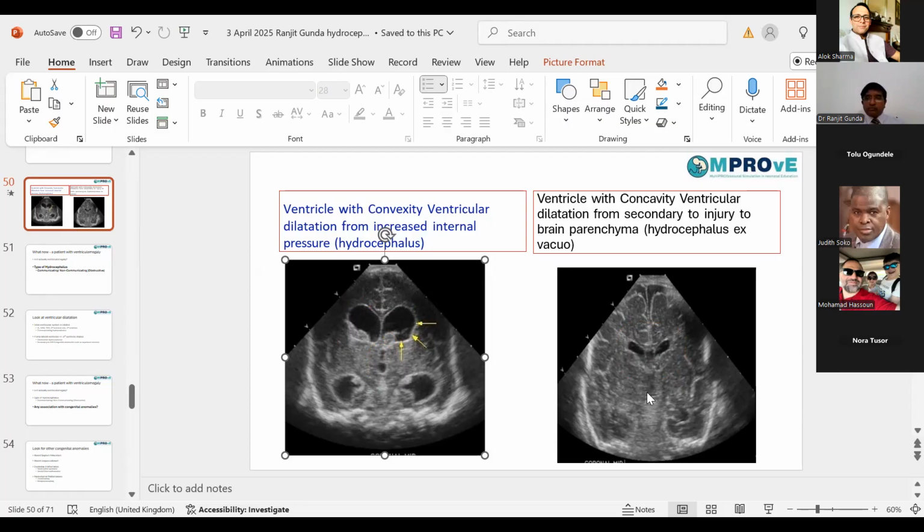We will be using the third ventricle that we are looking into. So when you look at the midline views, Sylvian fissures, you can see classical Sylvian fissures, you can see dilated ventricles, and really with the dilated ventricles, you basically have the foramen of Monro, which may or may not be blocked with a dilated third ventricle over here, which kind of indicates there might be a blockage below that. But in this view, seeing the fourth ventricle is very difficult.